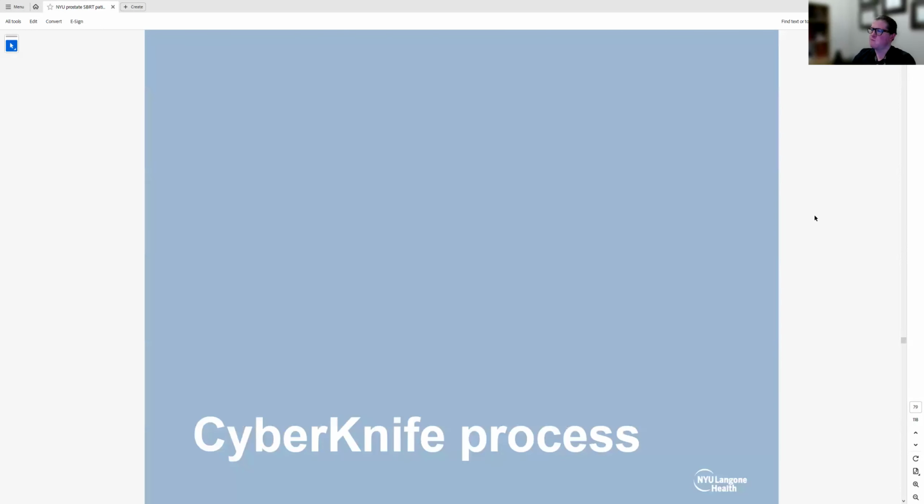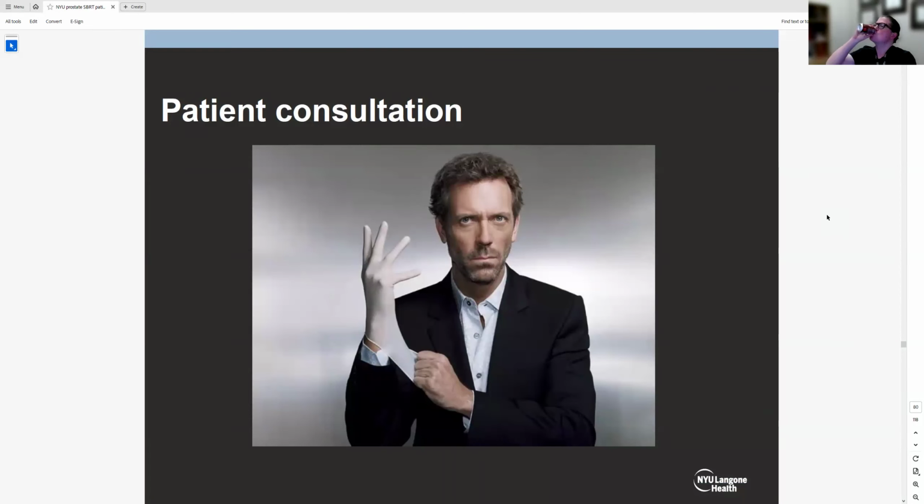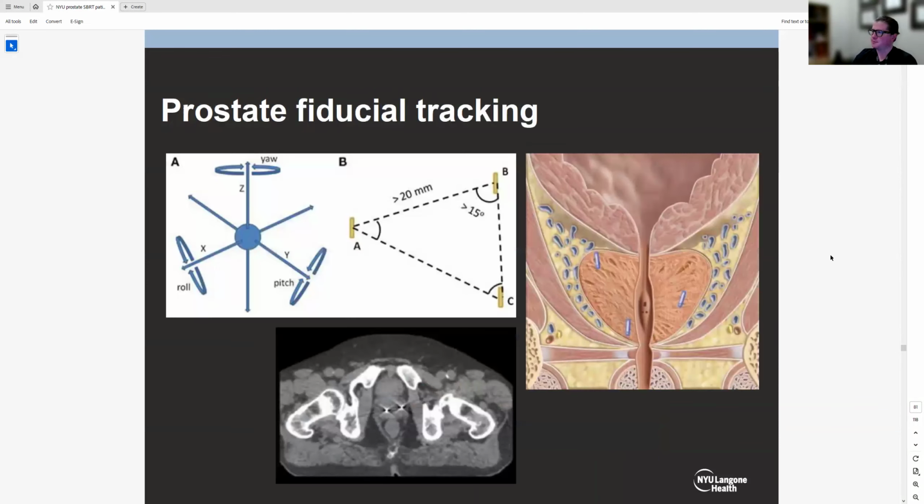So kind of walking through what it would look like to undergo Cyberknife treatment. And to some extent, this can be extrapolated to a variety of different radiation modalities. But the first step is really a consultation. And so you would come in and you would meet me, and we would talk about the problem we're dealing with, which could be any number of cancers, from prostate to brain or lung cancer, whatever it is. Sometimes it's not even cancer. We use this sometimes to treat other things as well. But a consultation really to walk through what the process looks like, the side effects, and how effective this can be, and what the data for it is.